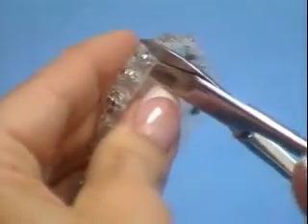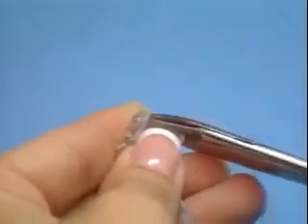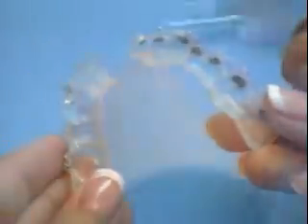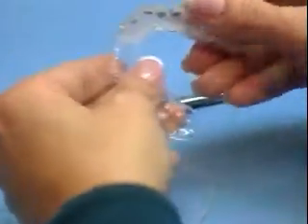Cut the soft inner tray at its midline to make removal easier in the patient's mouth. Replace the soft inner tray into the hard outer tray.